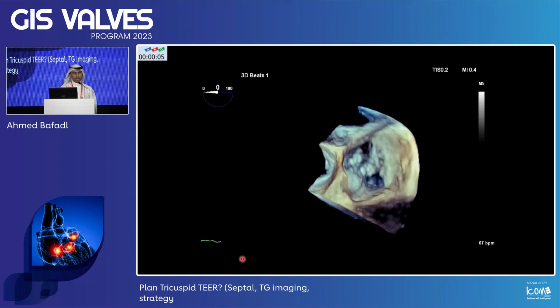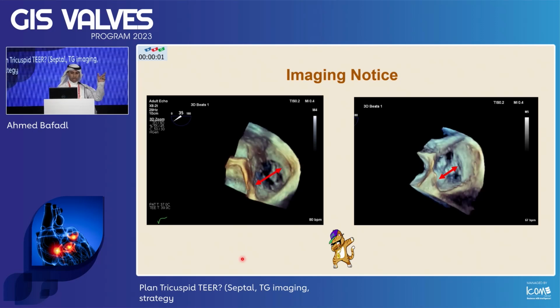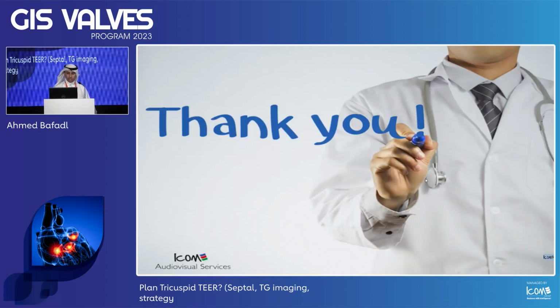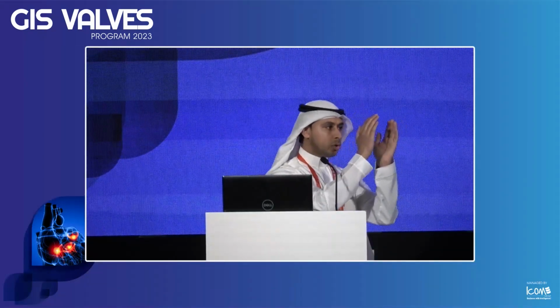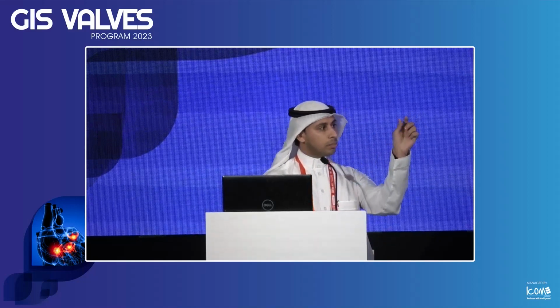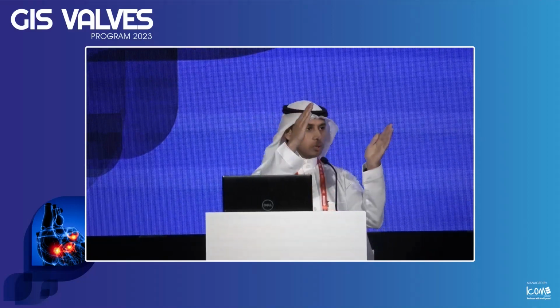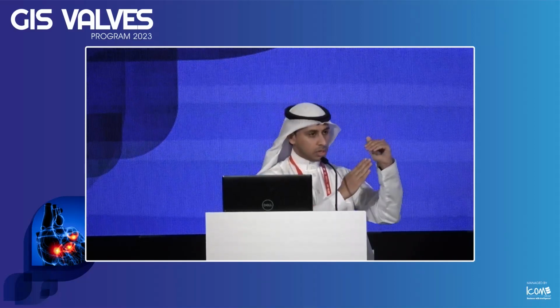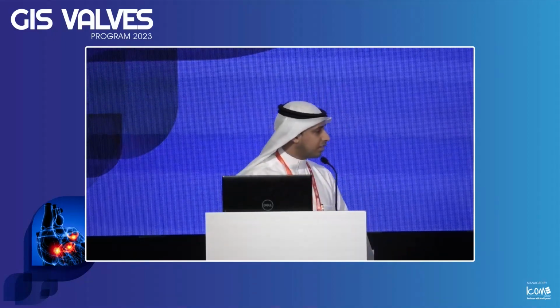Very good results. And then the tip here, if you have your middle clip, this was the last image, that will give you support for the annulus to close it in. That image will show you the middle clip especially brings the lateral wall of the RV closer, even if you have a posterior jet, posterior septal, that closes in sometimes, like in this case. But anyway, that was a couple of last slides. Thank you very much.